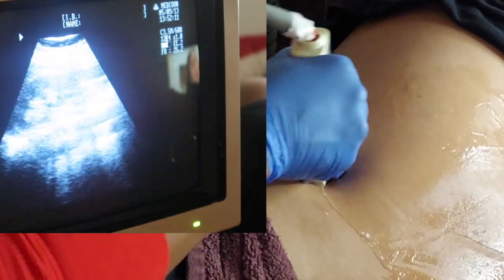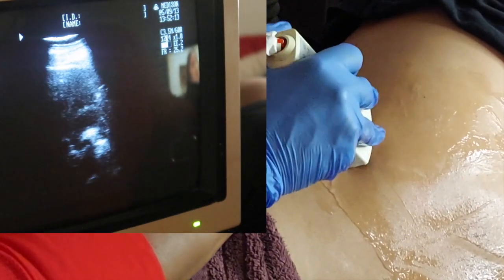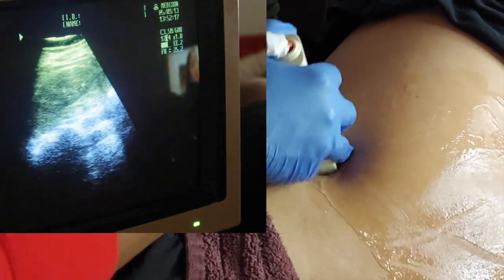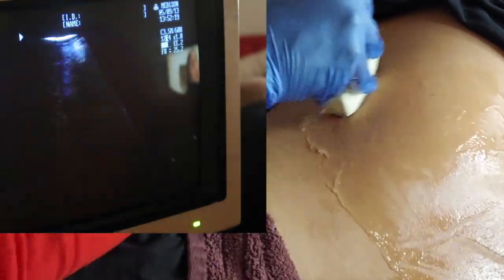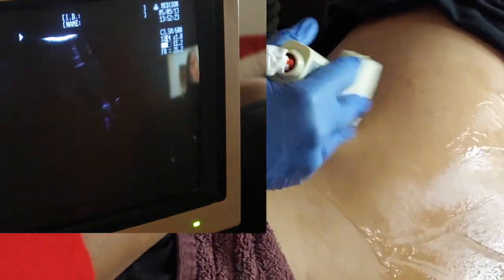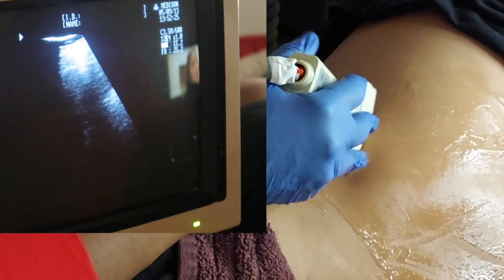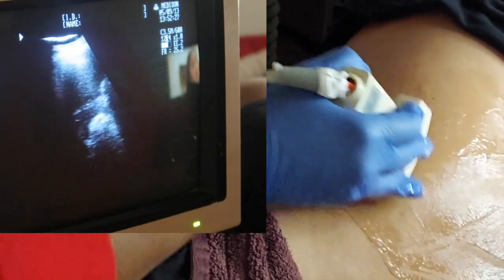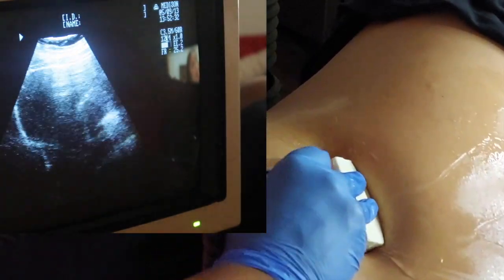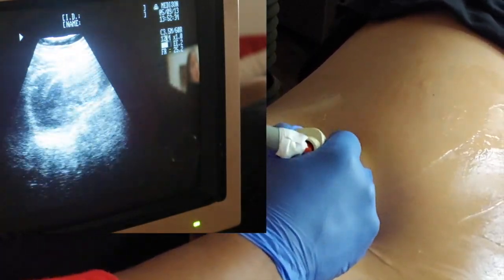Kidneys can be tricky, but your patient does not have to fast for this exam. You don't want to scan where the ribs are — same technique as my abdomen scan. You want to have the patient take a deep breath in and hold it so that kidney drops down underneath that rib cage, and you're pointing up into the rib cage.